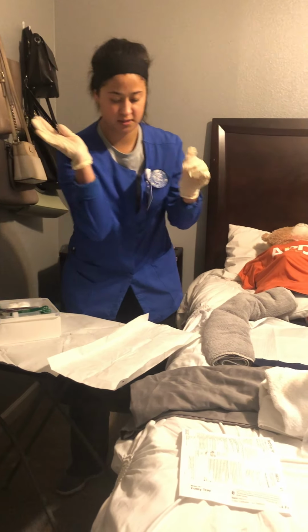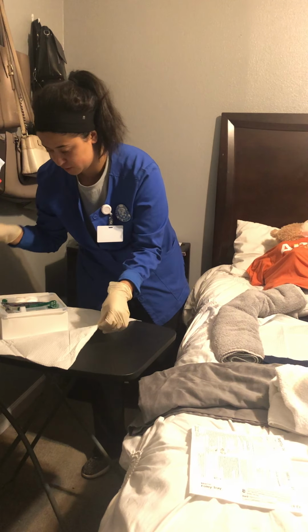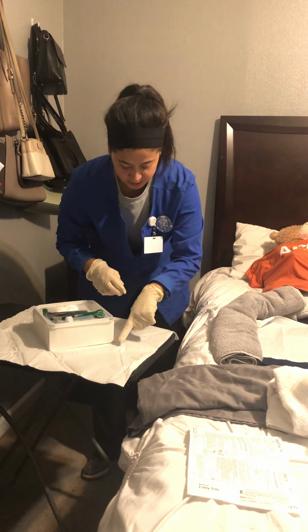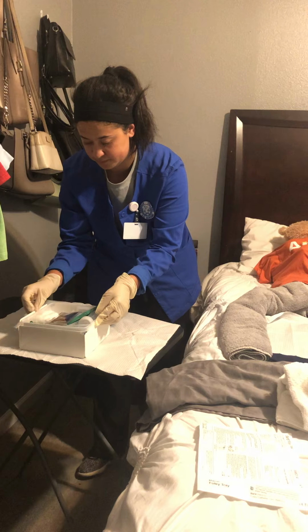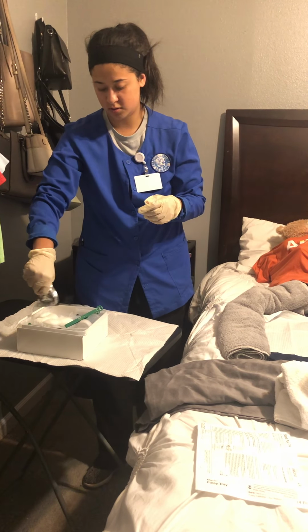And I can touch it because it's sterile to sterile. Then disregard of that, I'm going to scoot this back in. Oh, I need to touch the inside of it because I am sterile, so I need to touch here. I'm just going to turn this way. Move that there. I'll start by getting the iodine, placing it on the cotton balls.